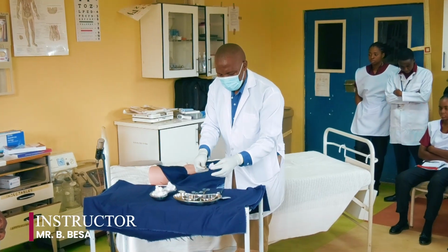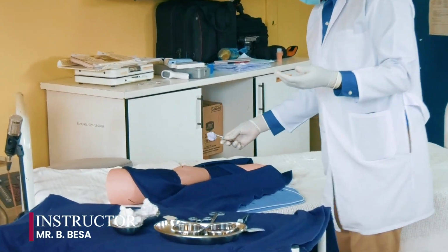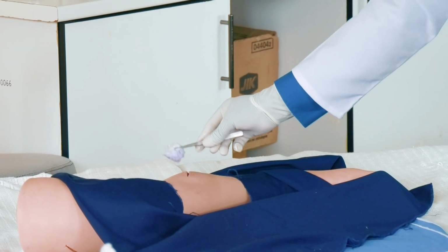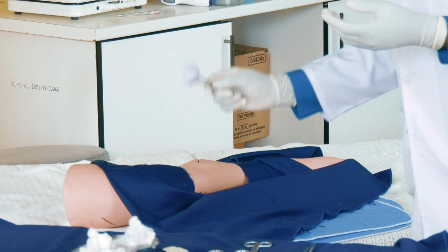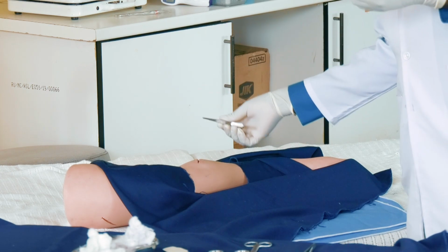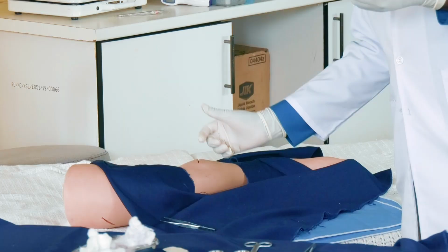When I use it here, I'm not going to take it back, but I can reuse later on. So I'll clean the wound, observe it, check if there is any infection and the like, then throw away this, because it came to the patient. I'll keep it here for now.